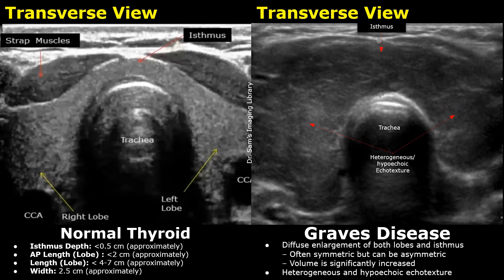Here is another case of Graves' disease. The thyroid appears enlarged, heterogeneous, and hypoechoic. The enlargement is asymmetric in this case — the enlargement in the right lobe seems more significant than the left.